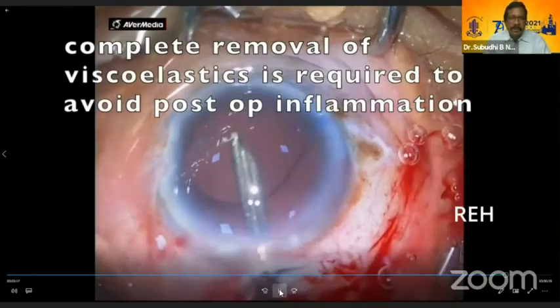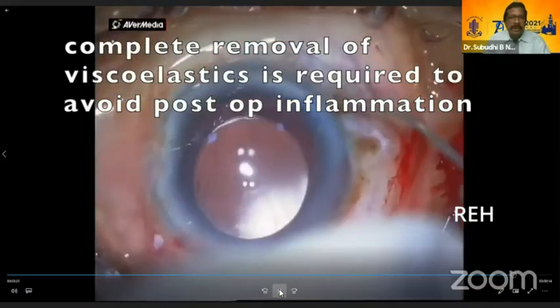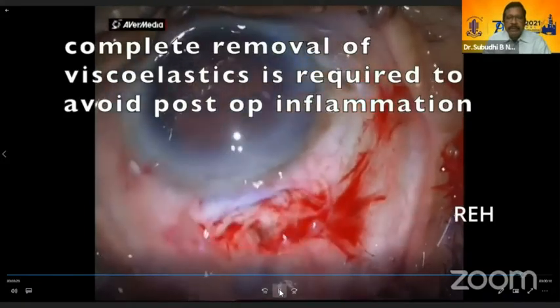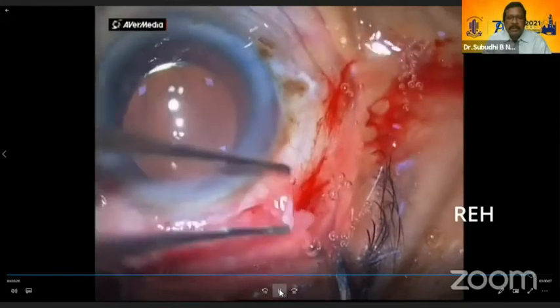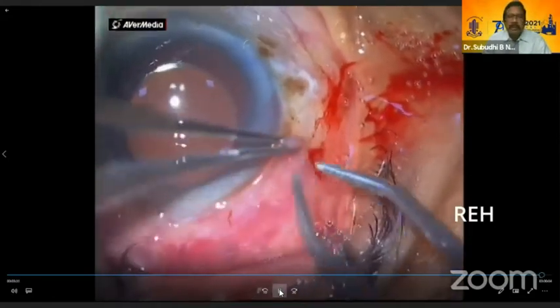So all these steps are very important. One must go methodically so that you don't let in complications. Close the conjunctiva with a small cautery, minimal cautery, so that post-operatively you don't get a congested eye. So I think my video explained everything.